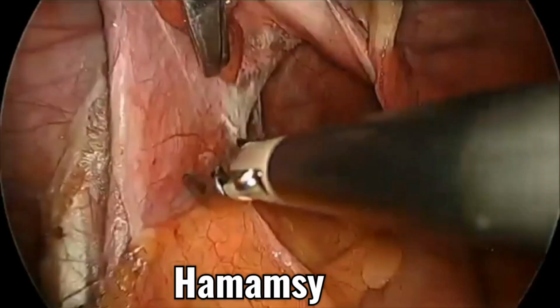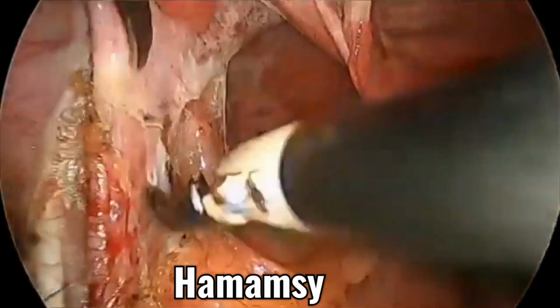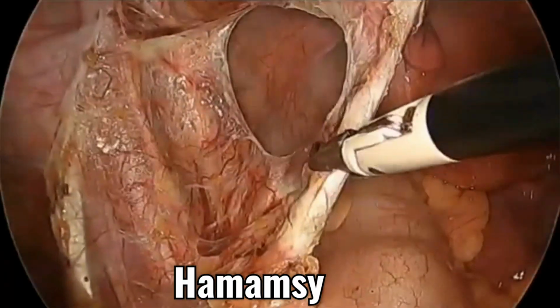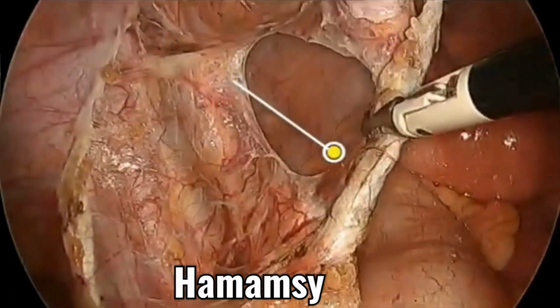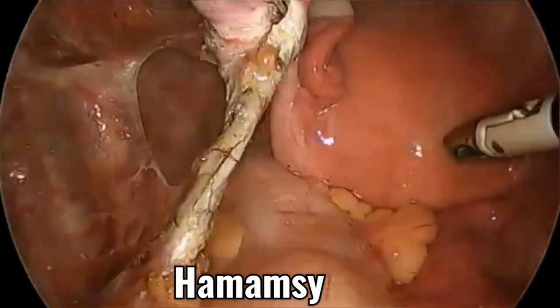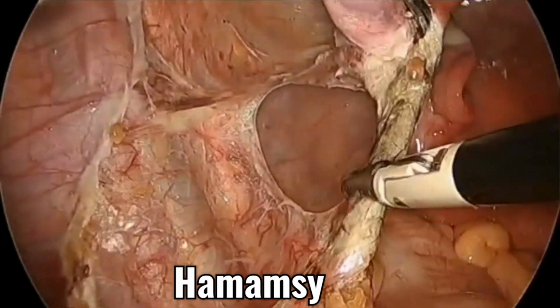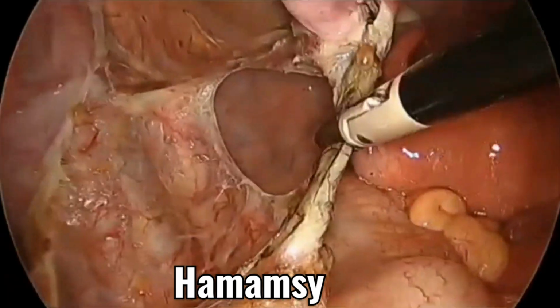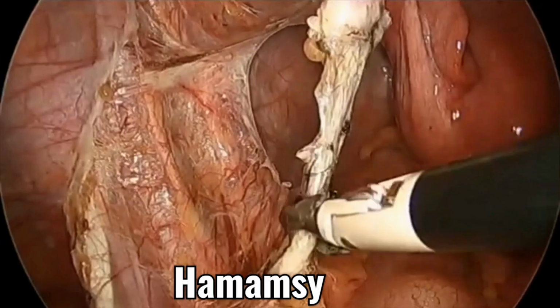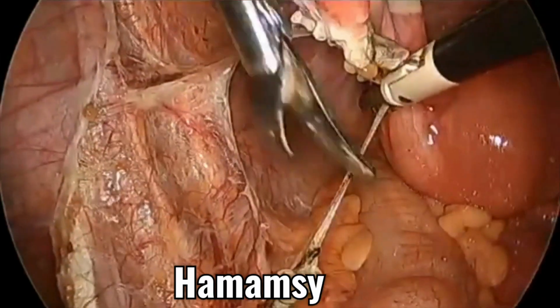اللي ماسكه ده الاي بي ليجامنت زي حضرتك شايف كده، وسكيلتونايزيشنز للاي بي ليجامنت، infundibulopelvic ligament, complete hemostasis, complete skeletonization, then cut using a cold scissor. Yes, very important.